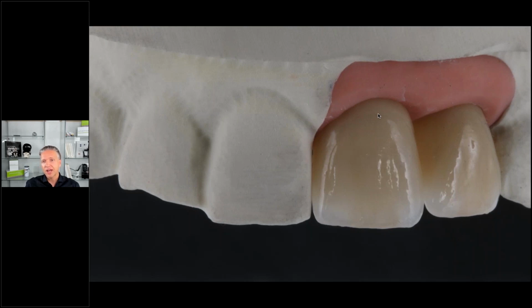Important is not just the tooth structure or tooth texture. Important is also what kind of base we have to work on. Our base is the model, right? And I want to show here different model materials in digital dentistry. This is a milled model. A milled model doesn't really give us a lot of information about tooth texture and anatomy. It's very important to understand.